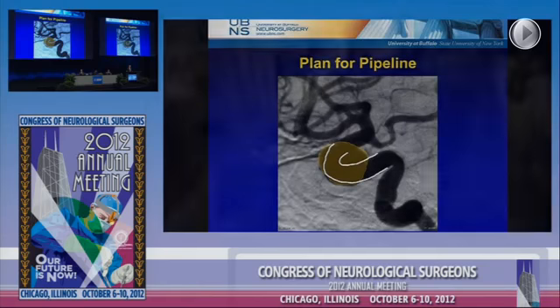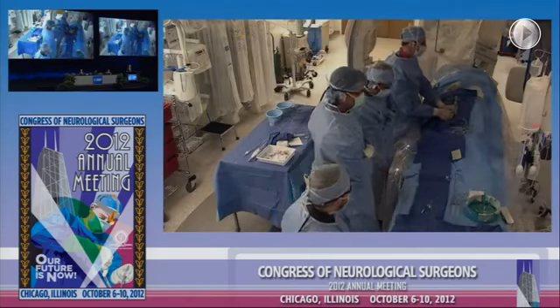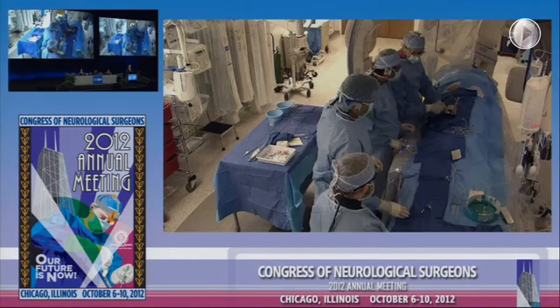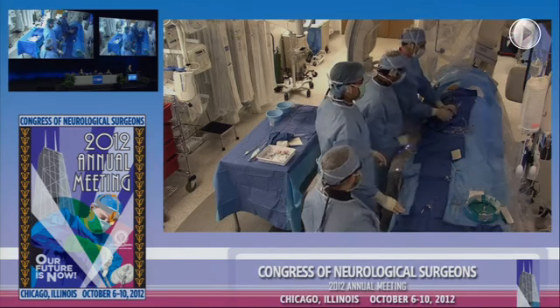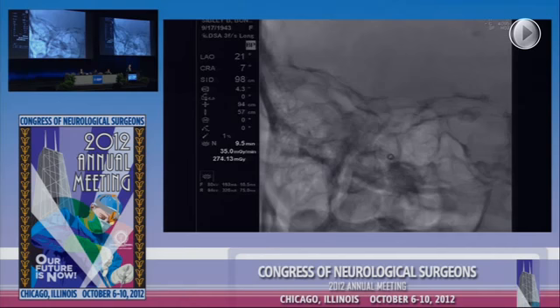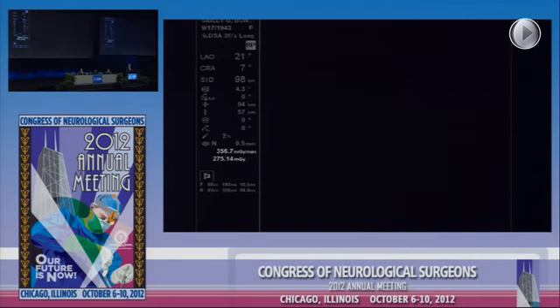If we can fluoro, Adnan, if we can go to the patient. This patient is awake. Can you come off roadmap, please? So she's awake and she's very cooperative. What we have so far is a very thick guide catheter and then a smaller catheter within that one, sort of a tower of power technique to get us parked with rigidity in the petrous carotid. This will allow us to push what we call heavy metal into the intracranial compartment without having our support herniate into the arch. Run, please.